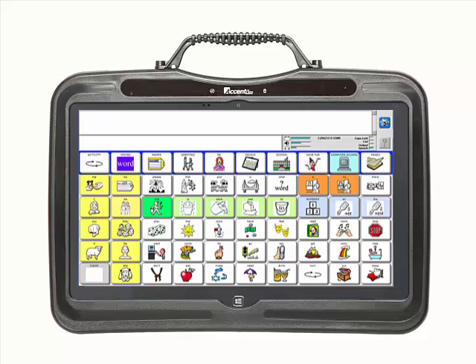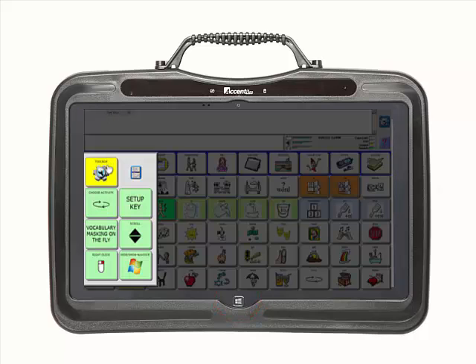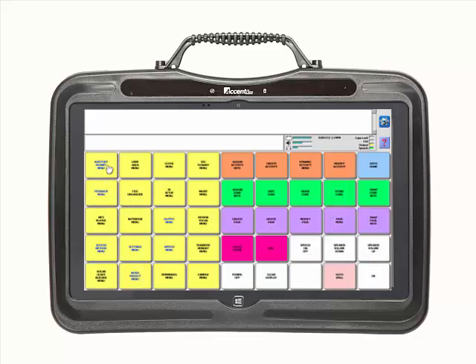There are two ways to enter the toolbox. The first method is to locate the home key on the frame of the device. It is located at the bottom of the screen in the middle. Select the home key. You will notice a set of keys that drop down on the left-hand side of the screen. Locate and select the yellow toolbox key in the top row of these keys. You are now in the toolbox.